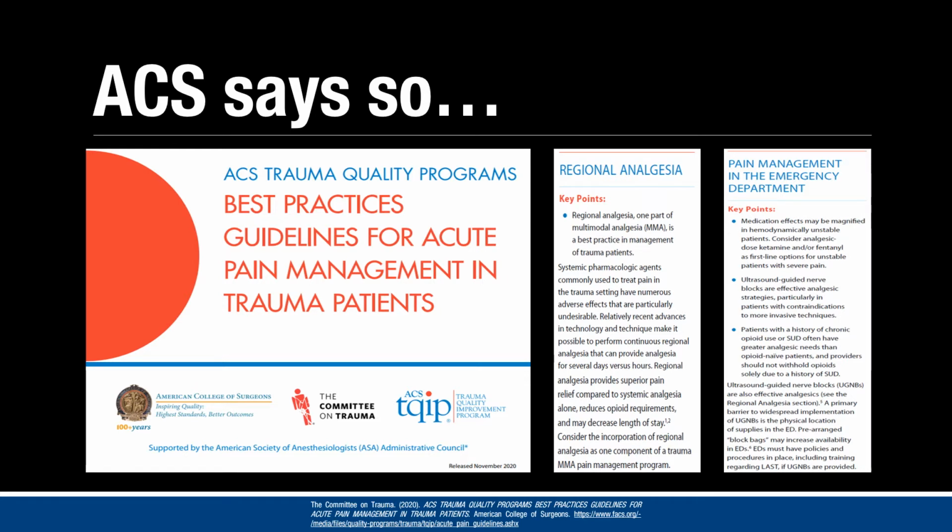And they actually suggest creating these prearranged block bags to help eliminate time and availability barriers to performance, as well as institution of policies and procedures governing performance of these blocks. So I think, not only are they advocating for us to be performing these blocks, they're also making recommendations as to how we can eliminate barriers to performance. So I think, between ACEP and ACS, we have numerous support for performing these blocks within the emergency department.